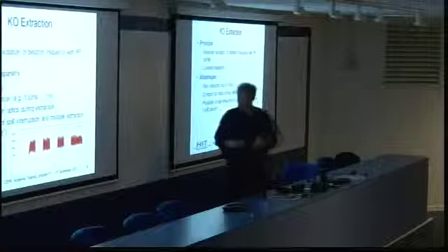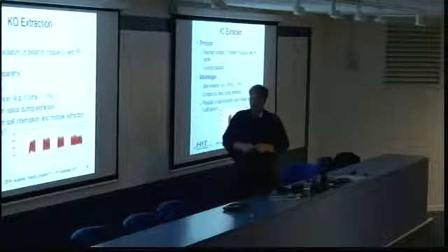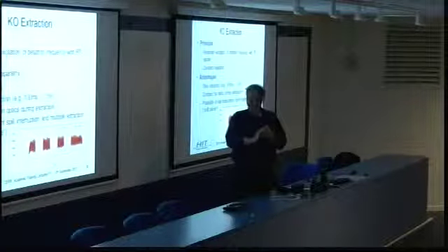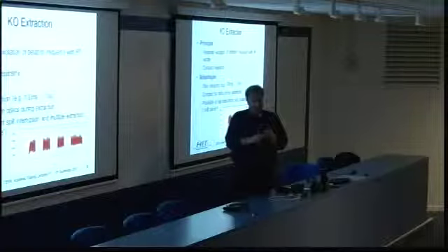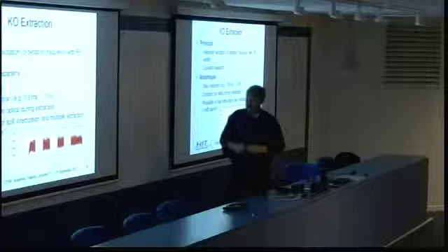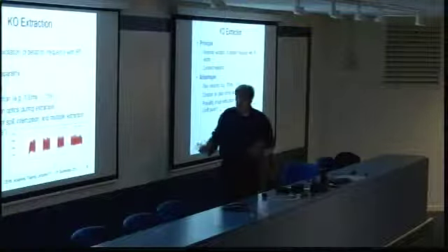If you think about one slice of a tumor, then it's not always the case that the area is only one area. It can be interrupted in several parts. So then you have to irradiate the first part of this slice.